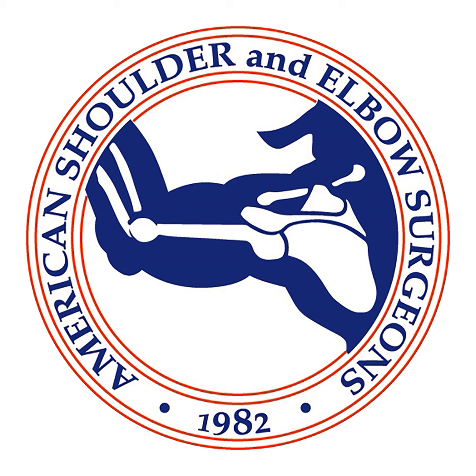So, over the 20 plus years I've been in practice, I've seen the transition. There were no stemless or short stems back then. Everything was kind of the standard length stem, which was anywhere from 120 to 170 millimeters in length. And many stems, when I was in training and early in practice, were fully cemented. And so we've seen the transition to cementless press fit stems, which in many respects is good.